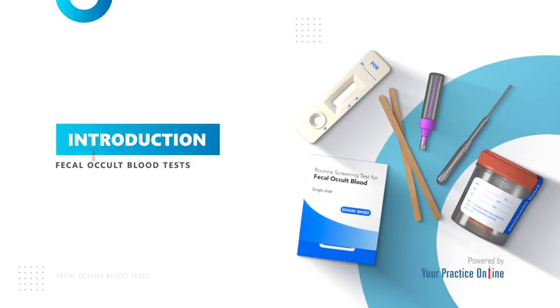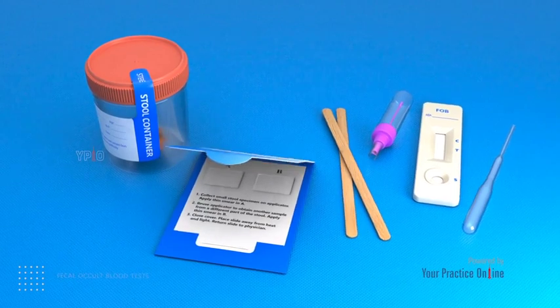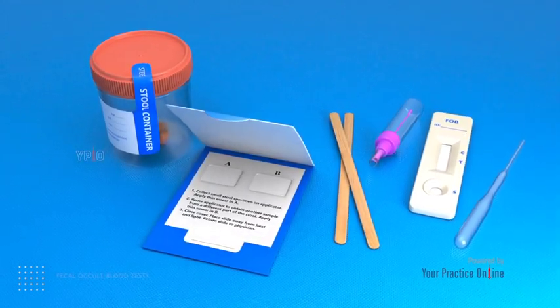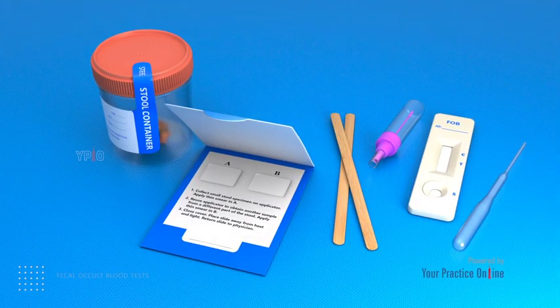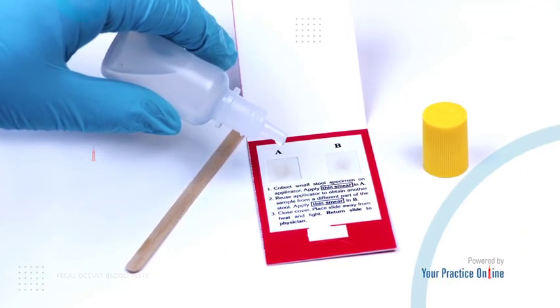Introduction. Fecal occult blood tests are non-invasive tests used to identify trace amounts of blood not visible to the naked eye in a sample of feces or stool. These tests can be performed at your convenience at home. The presence of blood in feces might be an indication of a problem with your digestive system.